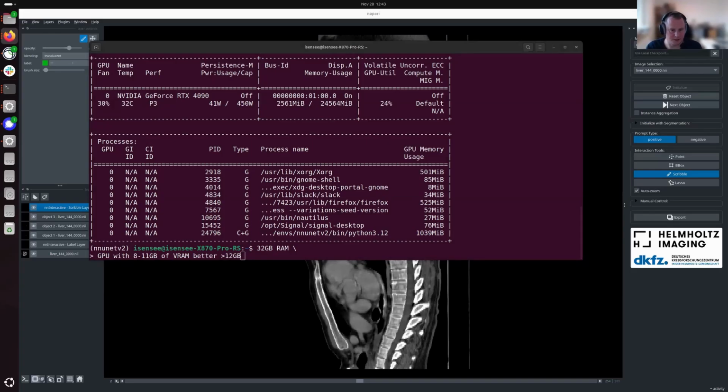One typical thing you do as part of preprocessing in the medical domain is to resample all images to a common voxel spacing, and this would potentially cause problems when you're really going for open-setness and cross-domain. So we do not do any resampling of images in nnInteractive. The whole thing operates on the original image in its native voxel grid.